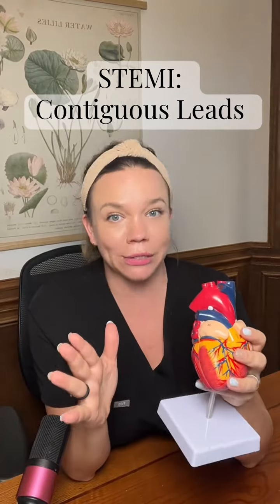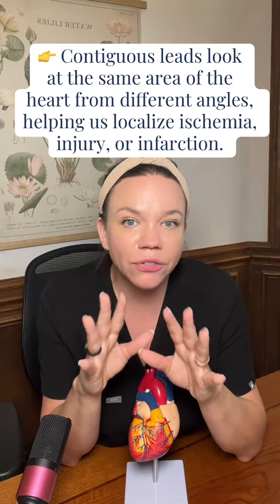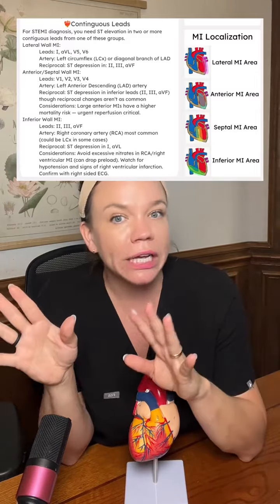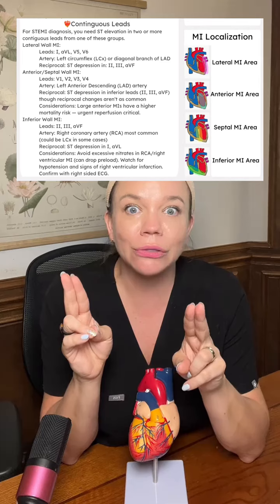To call a STEMI or not to call a STEMI, that is the question. If your patient is having a STEMI, you're going to need to see that in two contiguous leads. We have to start to memorize what leads look at what area of the heart so that we can know if we see an elevation in two of these leads, then we are concerned, super concerned.